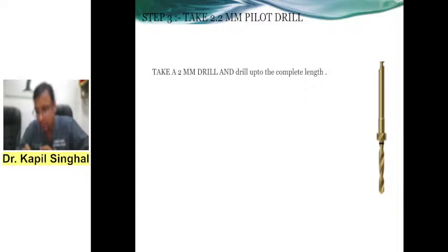So, if you get 2 millimeters in the question, you will choose the best answer as 2 millimeters. If the options are 1.5, 2.2, 2.8, 3.5, then the answer would be 2.2. So my second drill is pilot drill.